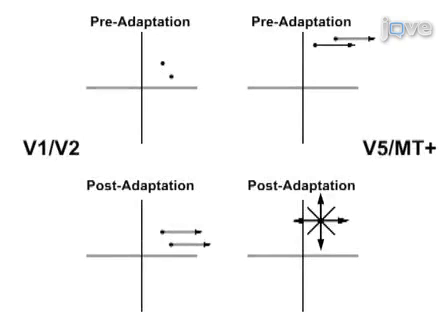Ultimately, results can be obtained that show specific, predictable phosphene behavior can be engendered through visual adaptation to unique visual stimuli.